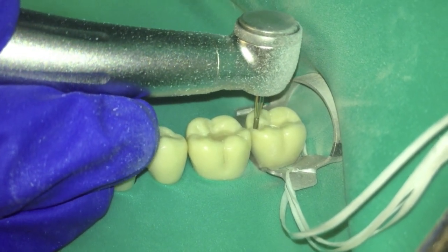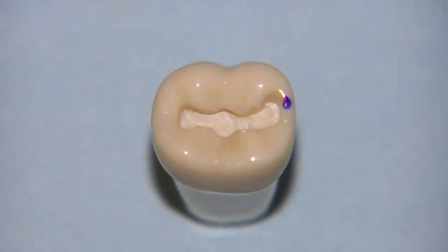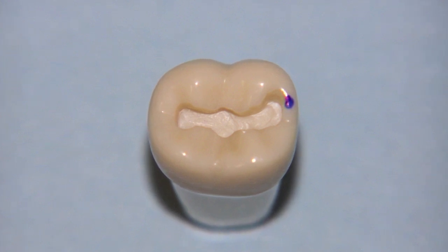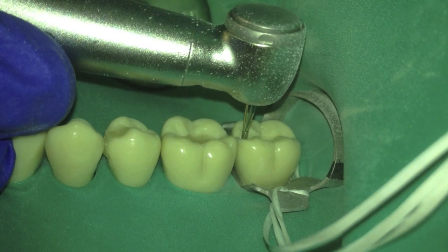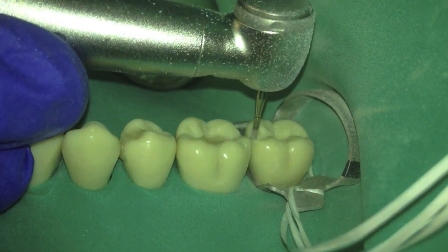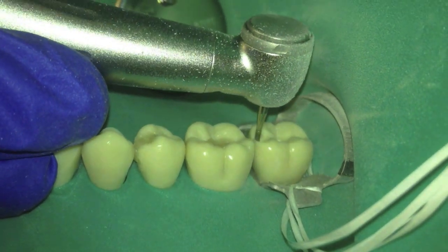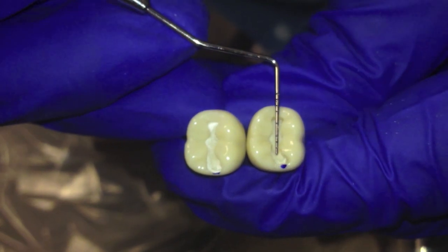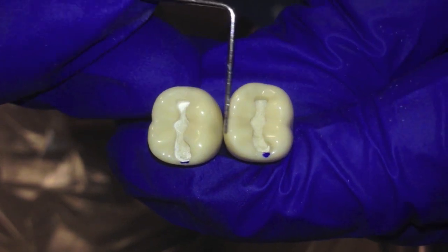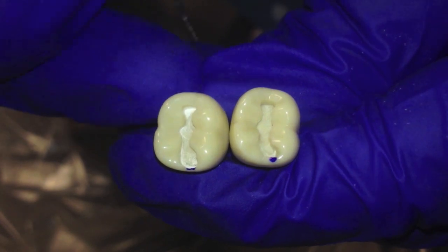Extend the preparation to include the reverse S-curve and thin the marginal ridge. Notice the buccolingual width for the box is centered around the contact point. Continue to thin the marginal ridge. The thin marginal ridge is maintained in order to provide protection for the adjacent tooth surface. The position of the Class I is centered from a buccolingual direction; the position of the box is centered at the proximal contact. The lingual proximal cavo surface will include the central fissure from an occlusal view.